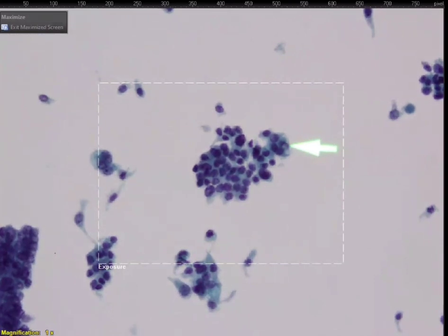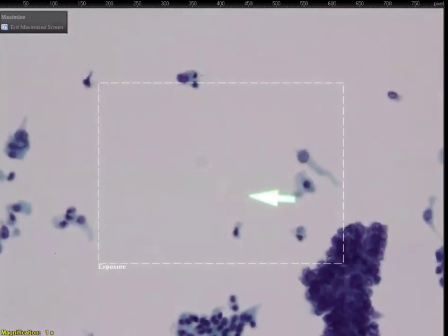Is this an inclusion? Yes. And the bottom, in this direction also, these two cells. The upper one, this one. Not great, but yes, it's kind of a group starting. Not inclusion. If it's a group, it's iffy, include. Yes, for sure. Okay, very good. Look at that, we didn't even have to go far.